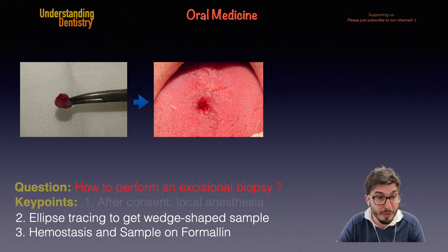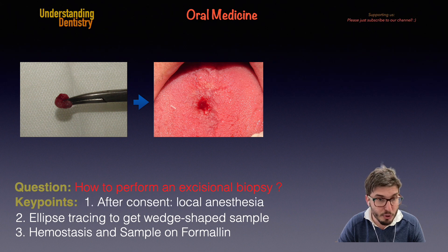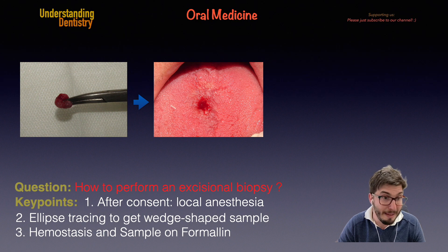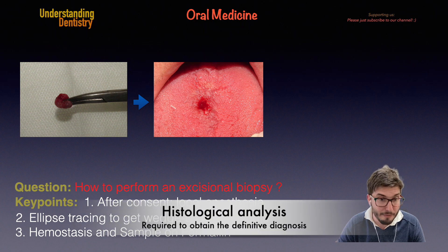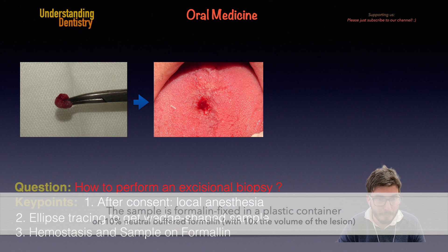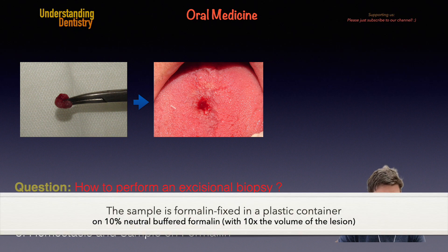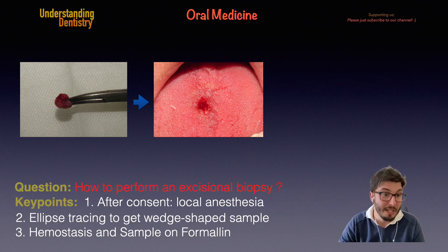Now you can see that we are using soft tissue forceps to remove the lesion. We need to be careful not to damage the lesion because we are going to send it for histological analysis. For this purpose, we place the lesion in a plastic container with 10% neutral buffered formalin.